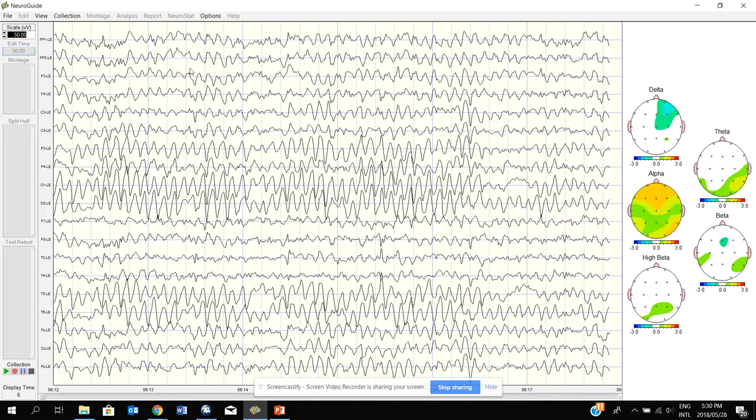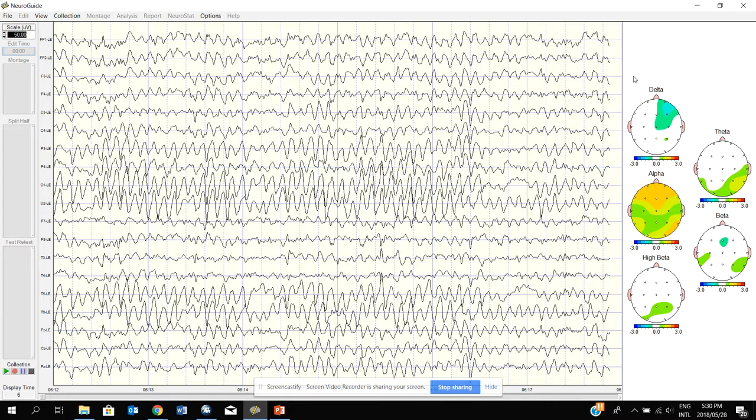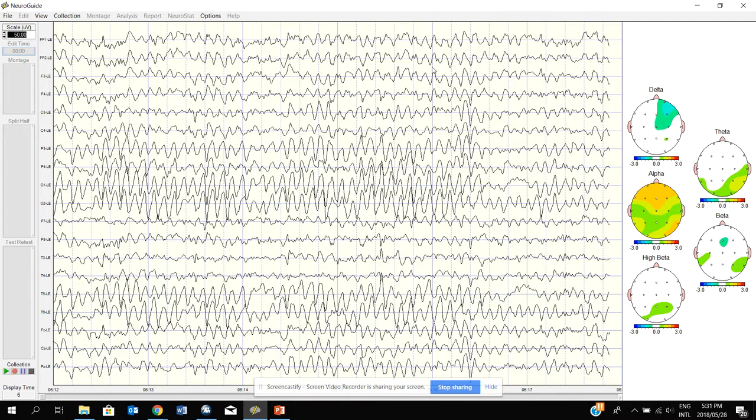Now, each line on the screen here represents a position on the head. For example, the top line, according to how we arranged this EEG, we call it a montage, this line corresponds to the forehead, the foremost part of the forehead, and it's called FP1. And then this line corresponds to the opposite side on the forehead as well, called FP2. And all these positions on the head are represented by these lines, but I won't go into detail about those, except to mention maybe one or two more.